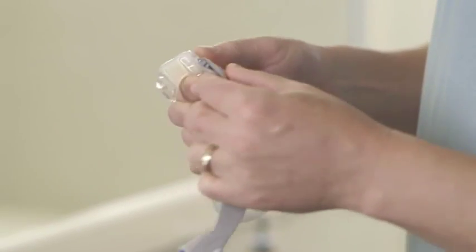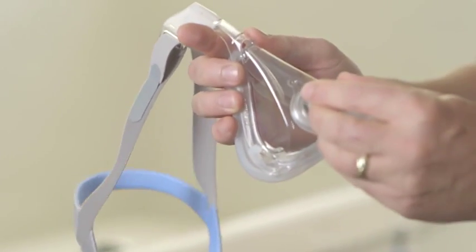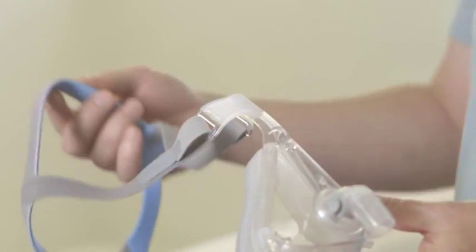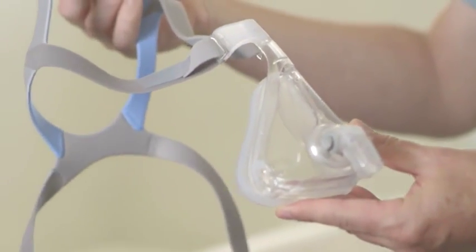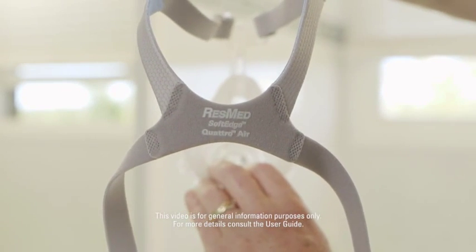Then attach the headgear into the top hooks and put the elbow back into the mask. Also ensure that both top tabs are reattached correctly, and the ResMed logo is visible at the bottom of the headgear. It should look like this.